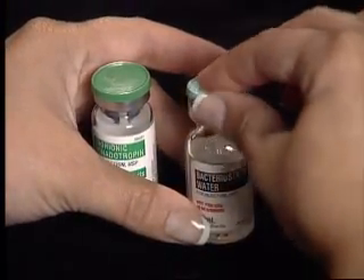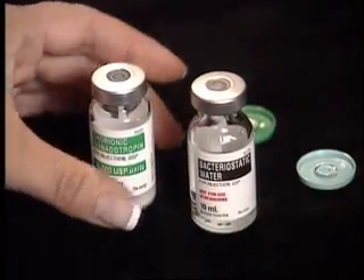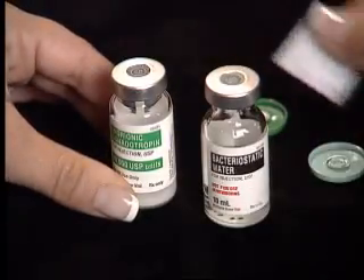Remove the plastic caps from the vials of powdered medication and diluent. Clean the rubber stoppers of the vials with an alcohol wipe.